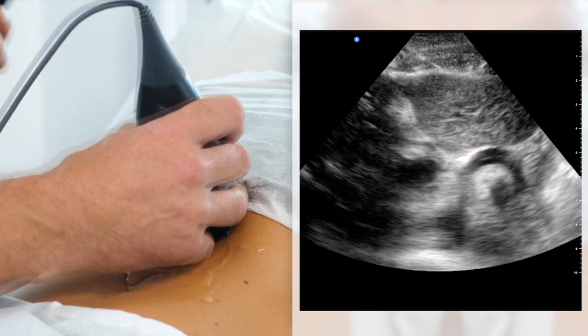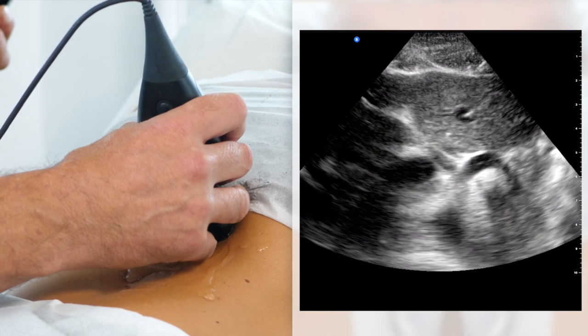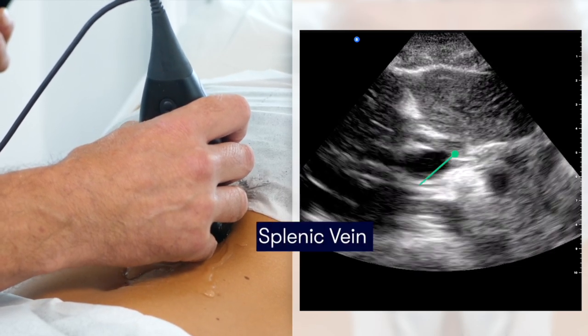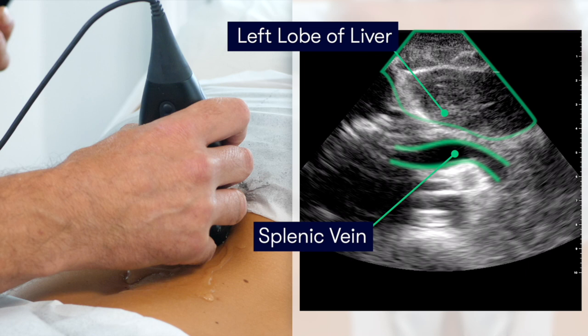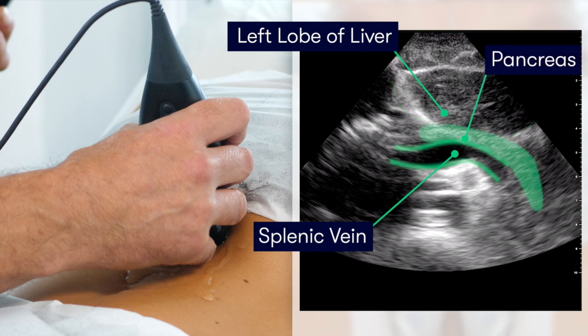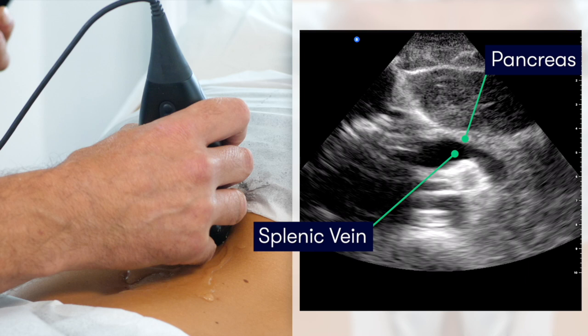As we move inferiorly, we can see the splenic vein is draped across the retroperitoneum. Superficial to this is the pancreas. The pancreas, in transverse section, is identified by finding the splenic vein, which we use as our landmark. This is the low echogenic structure that we can see in the middle of our screen, and the pancreas lies directly superficial to it, visible here as the grey band of solid tissue.